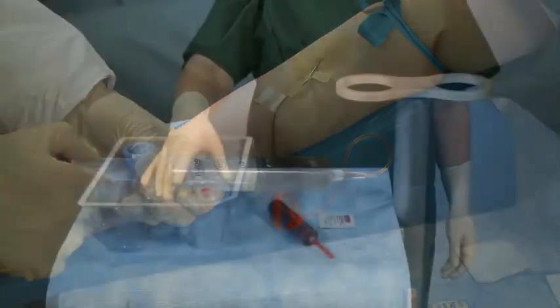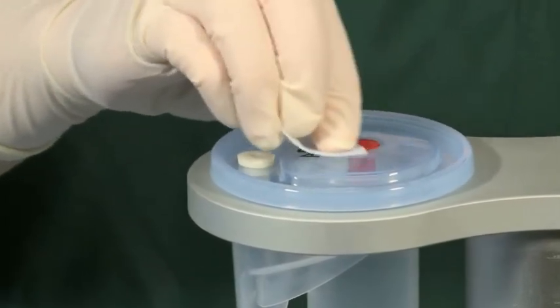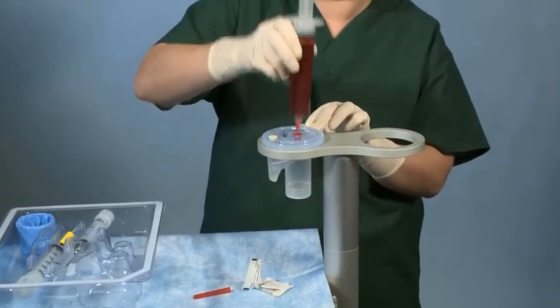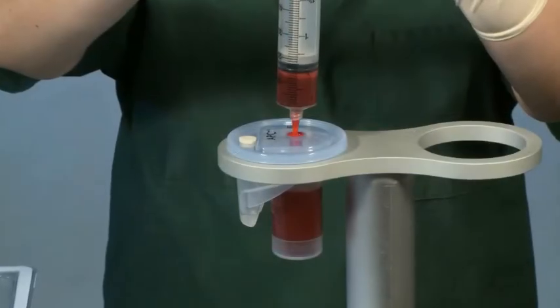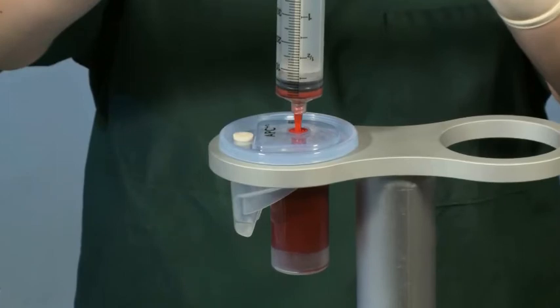For additional techniques, refer to the instructions for use in the process kit. When loading the blood, be sure to follow aseptic technique by first wiping the red port of the process disposable with an alcohol pad. Next, slowly transfer the total volume of blood from the blood draw syringe into the blood chamber of the process disposable, which is marked with a red port.